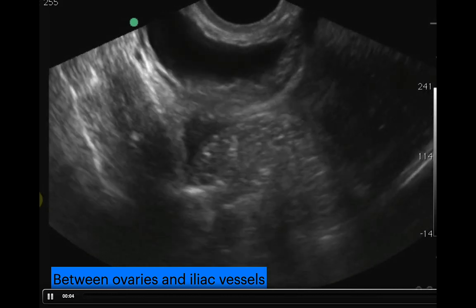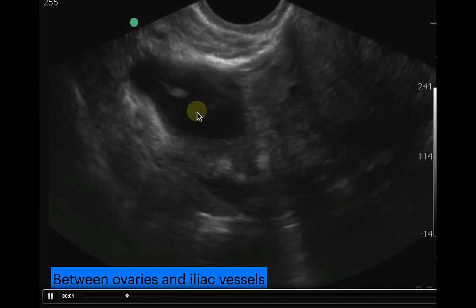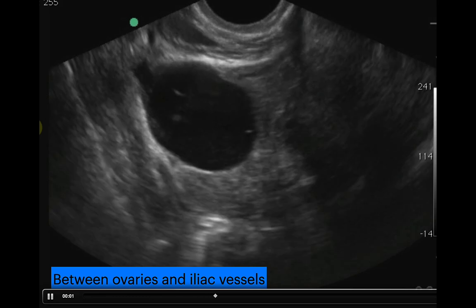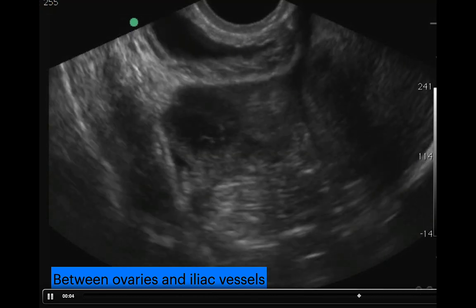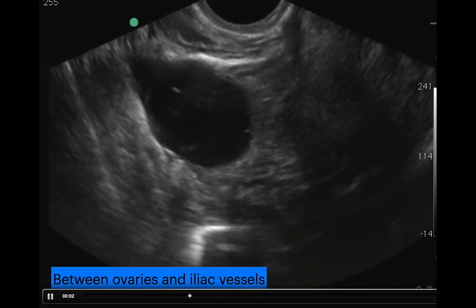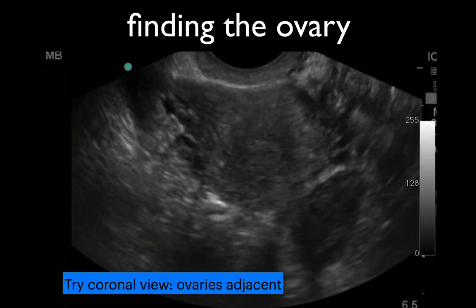So this is a little complex ovarian cyst, a little bit of free fluid around it. This up here is bladder. You can tell by the thickish wall that's kind of sitting around it. It's well contained. All right, so if you get to this point down here, iliacs, you want to just turn around. If you can't find it with that, then go ahead and switch to coronal view.